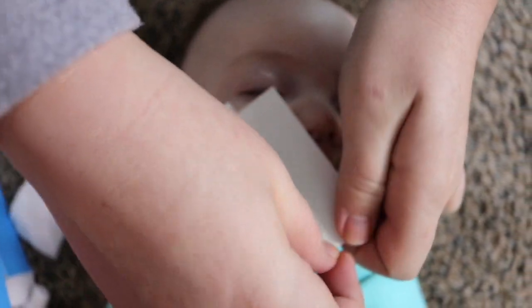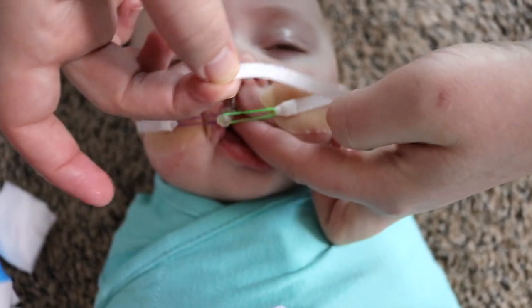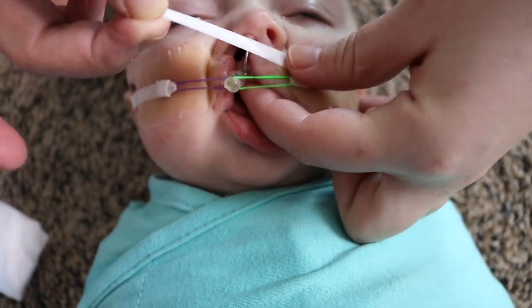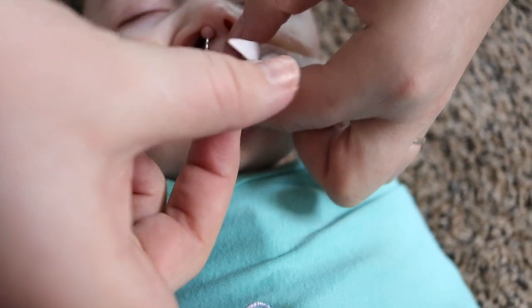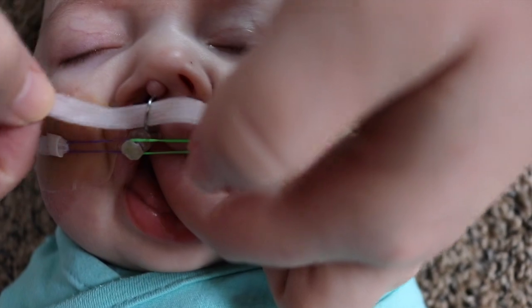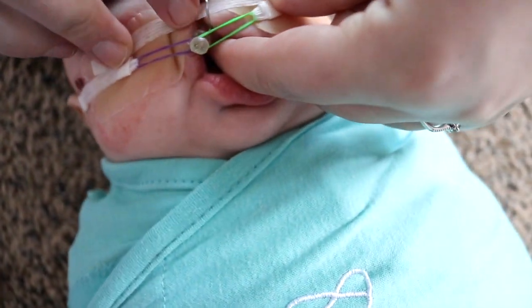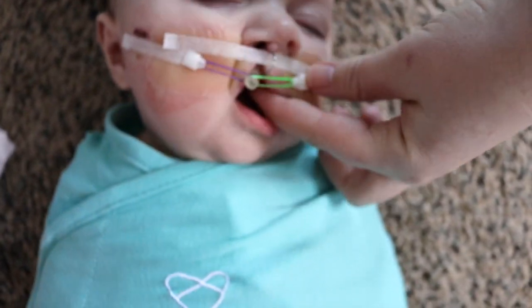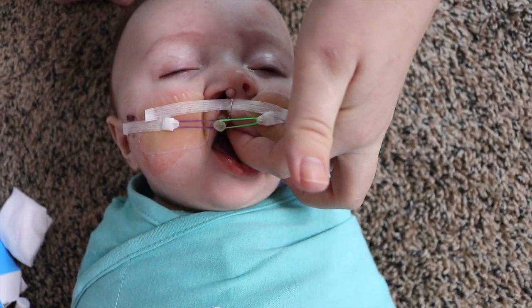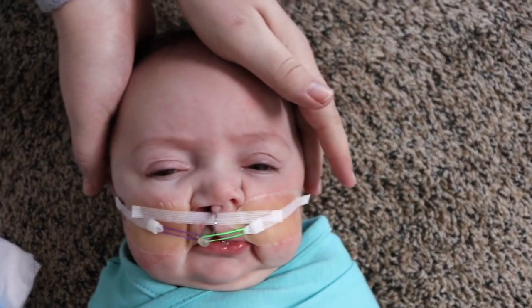Now I take what we call the mustache tape — this one is used to pull his lips together. I attach it on one side and thread it underneath the nasal stent, which gets a little tricky sometimes. Once it's underneath, I squish his lips together and secure it on the other side. I just make sure the NAM hasn't popped out during the process because sometimes it does. And there you have it — that's how you put in the NAM.